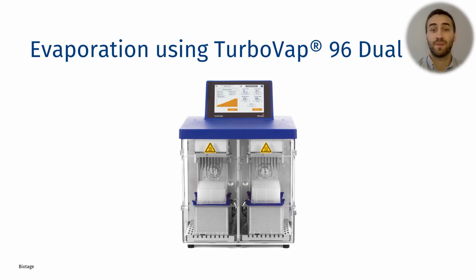Both the DoA and the THC panel were evaporated to dryness and then reconstituted with the details explained in the application notes. So the evaporation can often be overlooked during method development. It's a very important step, so it is vital to ensure that this step is suitable before proceeding with any further development. It is very easy to lose your analytes of interest at this stage, so I'd always recommend to do this early in method development.